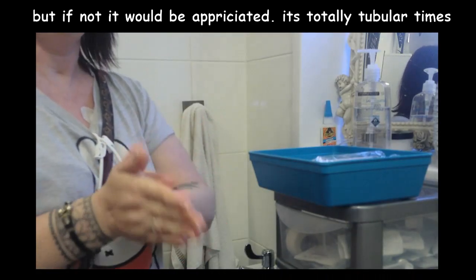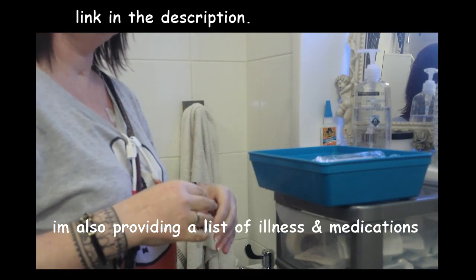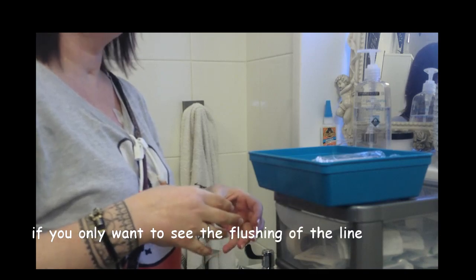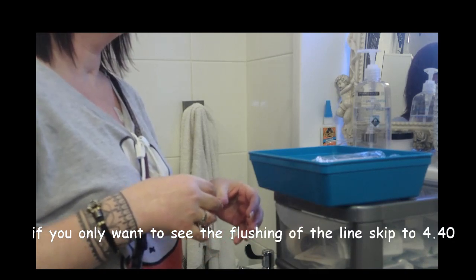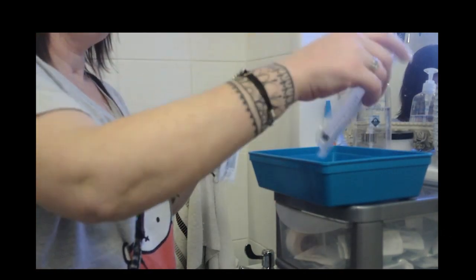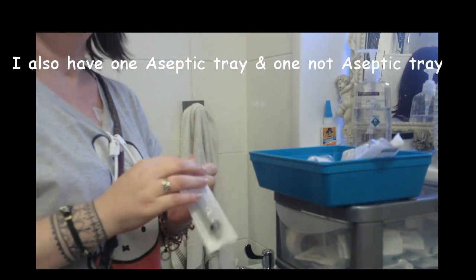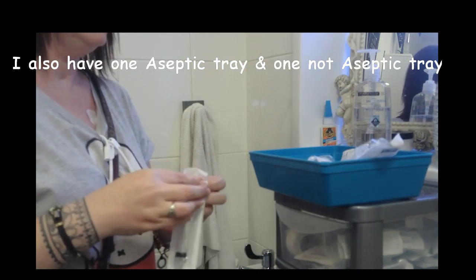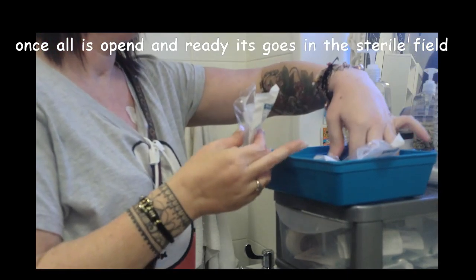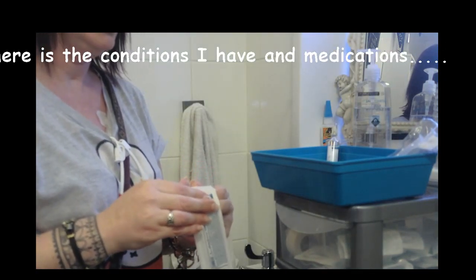We don't wear gloves. I was taught not to use gloves because with gloves you keep touching things, forgetting that you've already touched the packet, and then you're not repeatedly gelling your hands. So for this and for my infusions, I have to just keep gelling my hands. When I've opened the packet, I gel my hands again. I don't take the things out of the packet until I'm going to use them, so I leave them all in the packets, ready.